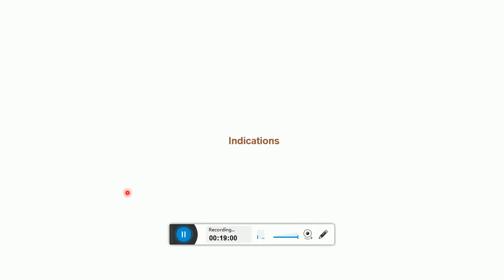Now, indications. Visual field testing is practical in various clinical scenarios. Number 1, diagnosis and progression of glaucoma. Number 2, assessment of neurological conditions concerning the visual pathways. Number 3, documentation of field defect and assessment of progression in retinal diseases like retinitis pigmentosa and inflammatory conditions like birdshot chorioretinopathy. Number 4, part of the visual disability certificate or driver license. Number 5, the legal definition of blindness. Number 6, evaluation of unexplained visual loss.